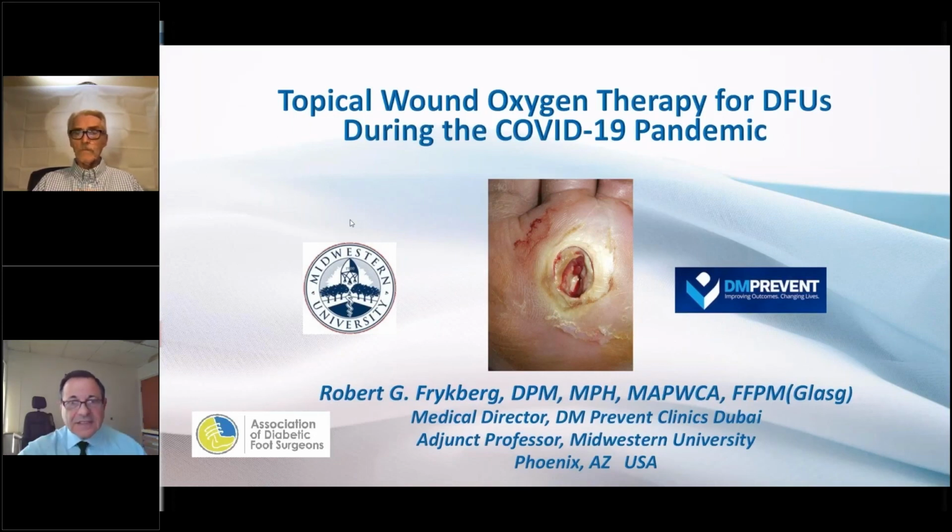And let's see if we have some other questions here. I have one. How can we take advantage of the wound center or the wound center without walls when we're using topical oxygen? Well, I think basically it fits very nicely into this. This has always been a home-based therapy. All patients utilize this at home. In fact, in our trial, no therapy was ever delivered in the clinic or in any wound center during the trial. Every treatment was done at home.